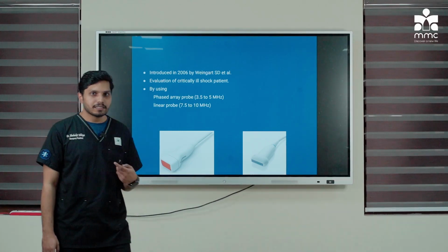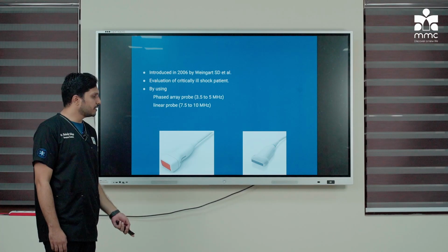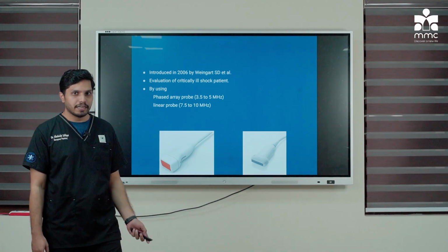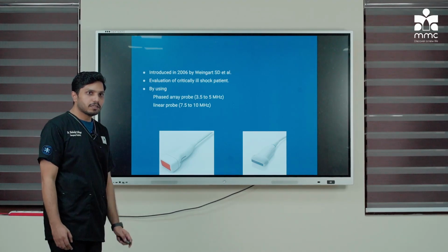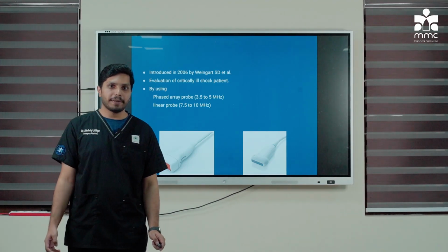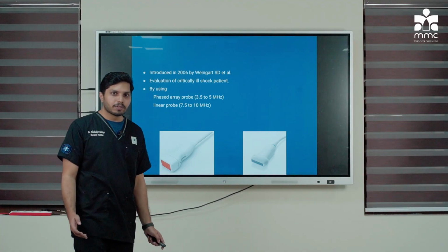So the RUSH protocol was introduced in 2006, and it is commonly used in ED scenarios. It is used to identify a shock patient in an emergency department. I think everyone knows about shock.